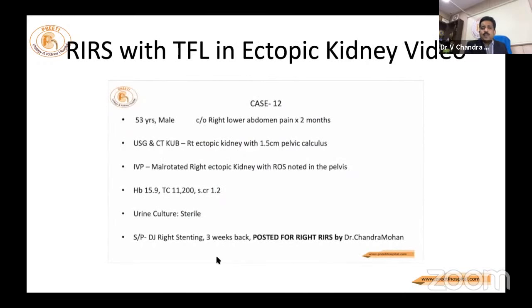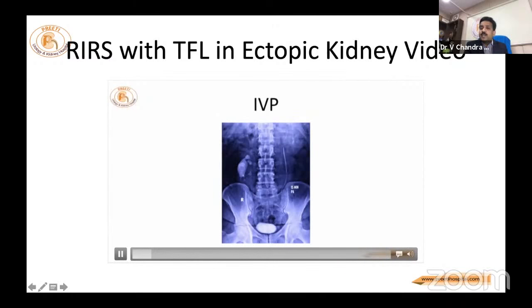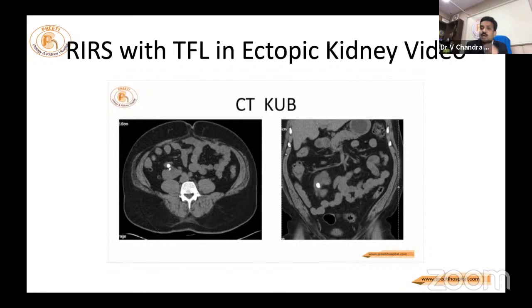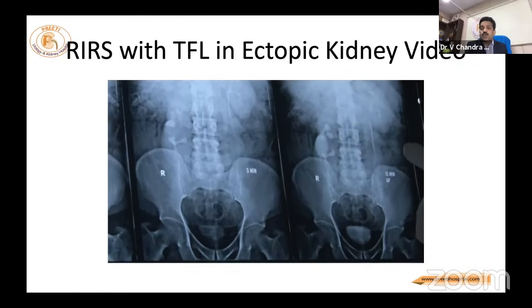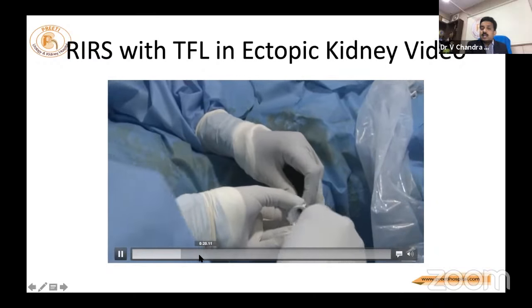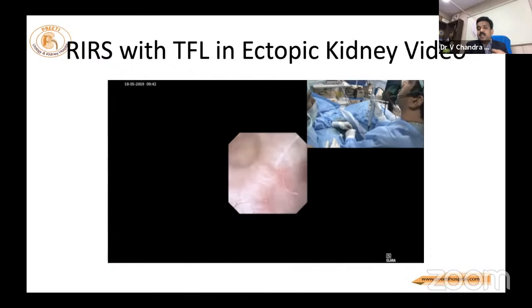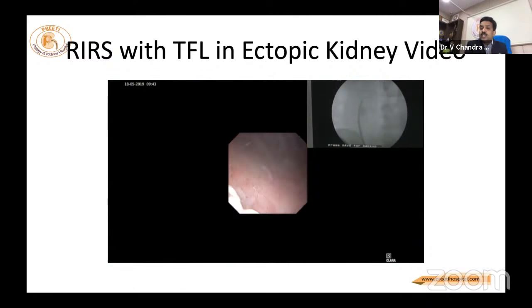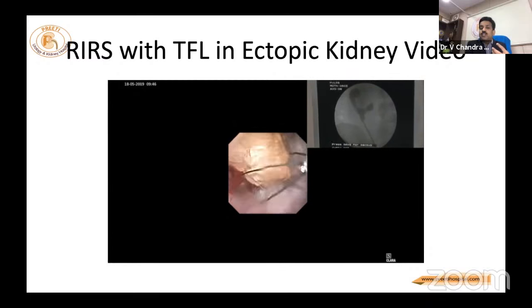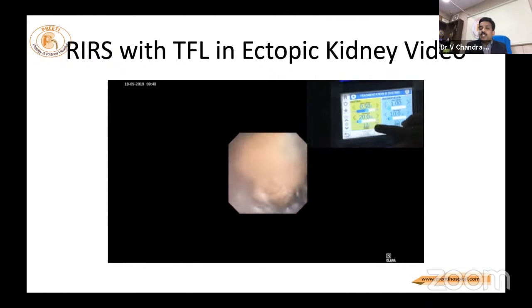Last case, ectopic kidney, where an important part is the anatomy of the ectopic kidney. If you move the stones into small calyces, your SFR will go down. You cannot go into such stones. This is a big stone in a large capacious pelvis. See how much bending is there, and then a small laser fiber of 100 microns, if it comes, you can do in situ also. See, one small stone is taken back and put into the major stone. The important thing is it should not move.